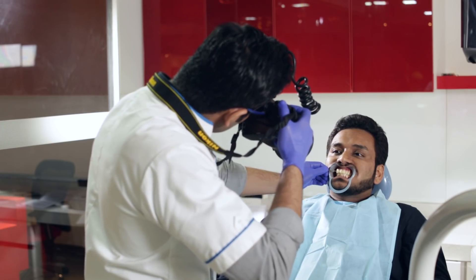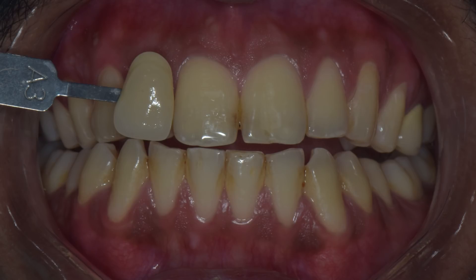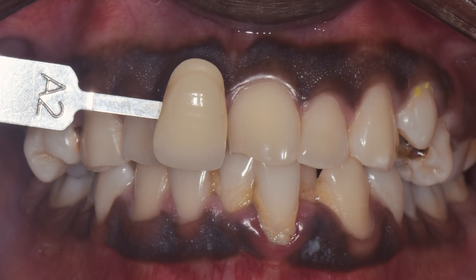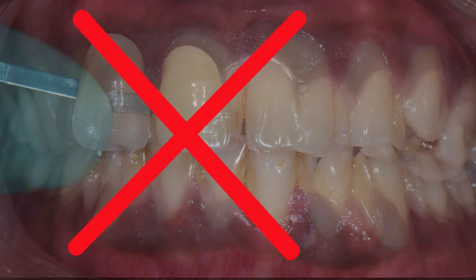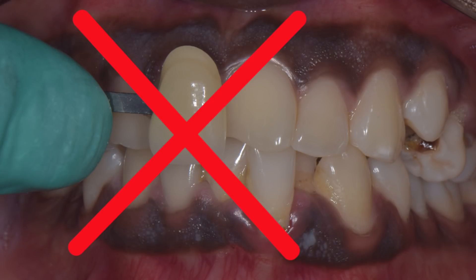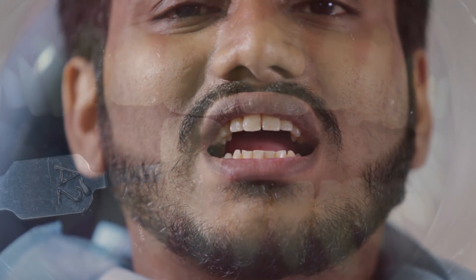Always send good, high resolution photographs of the teeth with the shade tabs, preferably using a DSLR camera with a good macro lens and a flash. You can also take a black and white photo to confirm the value. Always choose the shade tab closest to the shade of the tooth. While taking a photograph with the shade tab, always ensure that the coating on the tab is clearly visible — you don't want your finger to obstruct the view or not have the tab number in the field at all. While matching the incisal edge, always hold the incisal aspect of the tab towards the incisal edge and not the other way around.